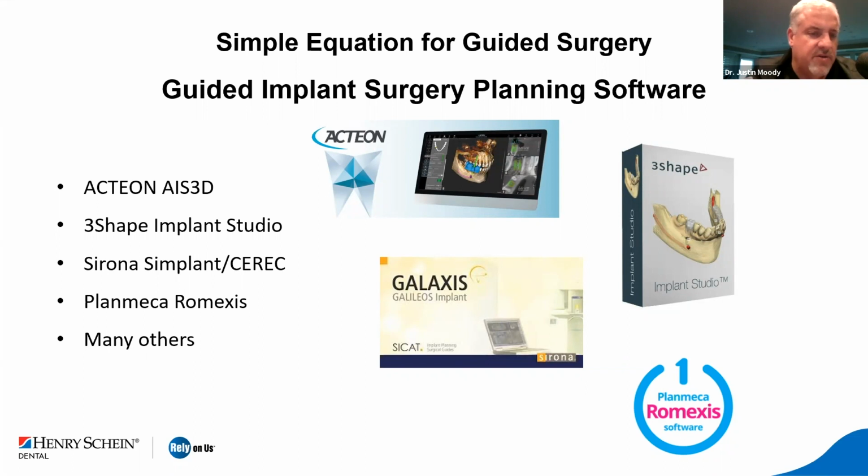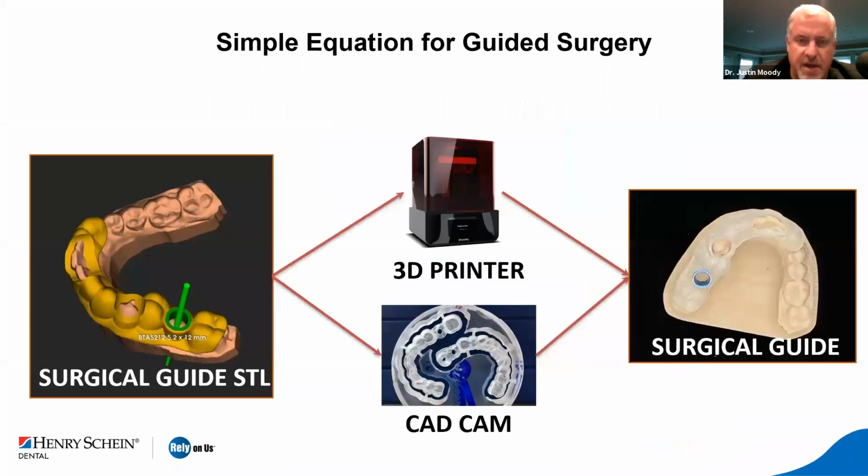And there are many, many others. There's some other free softwares out there, but these are who I consider probably some of the main players, with maybe one exception of some Blue Sky Bio in this section. All of these softwares are going to literally take that DCM file and that STL file and put them together.